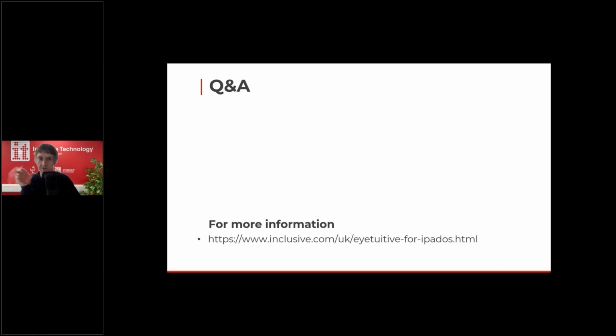The power charger to do that is included with the package as well. If you wanted to learn more about that, there's more details on our website. You can see the link there for Eyetuitive, the product page.